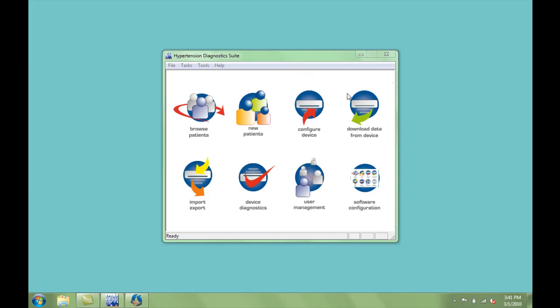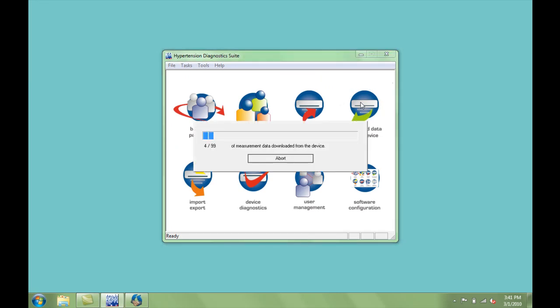From the main menu, click the Download Data from Device icon to obtain the data measurements from the ABPM unit. Note that the data is downloaded to the appropriate patient file on the computer based on the initial device configuration.